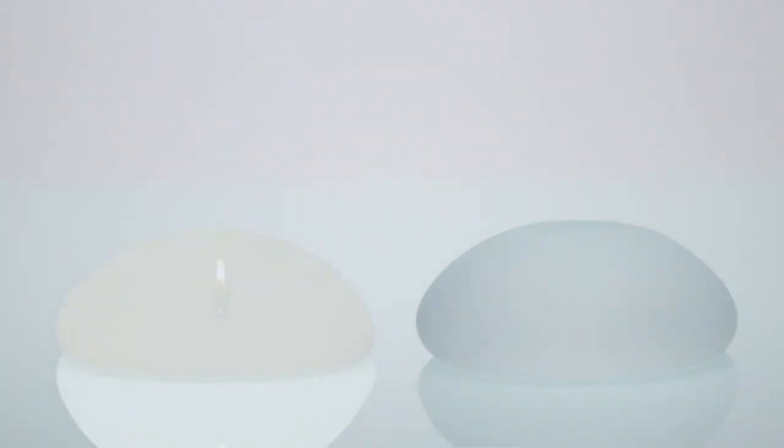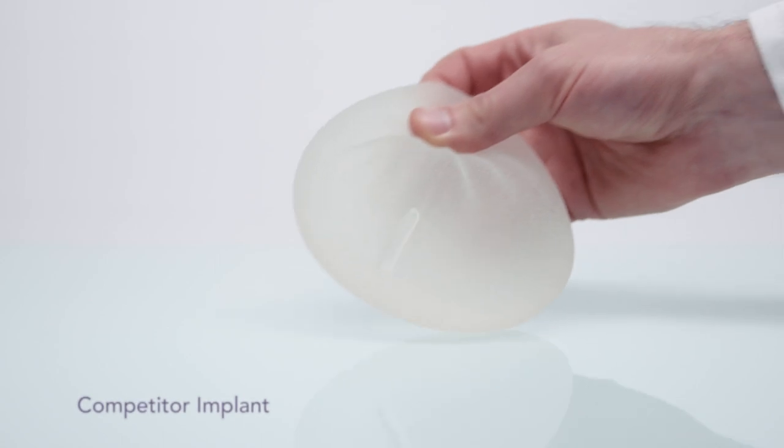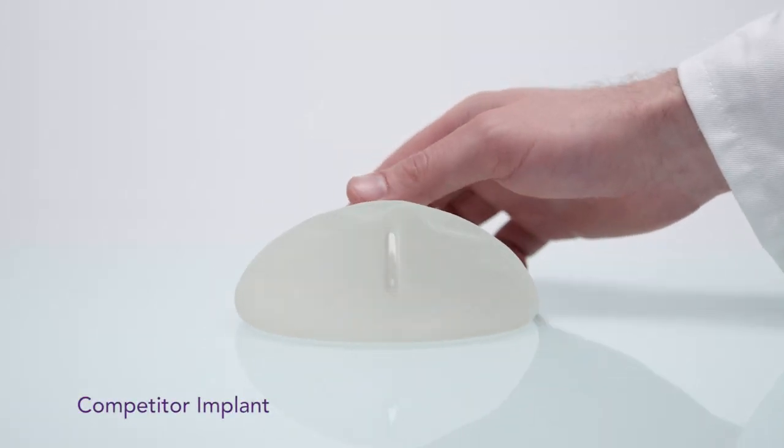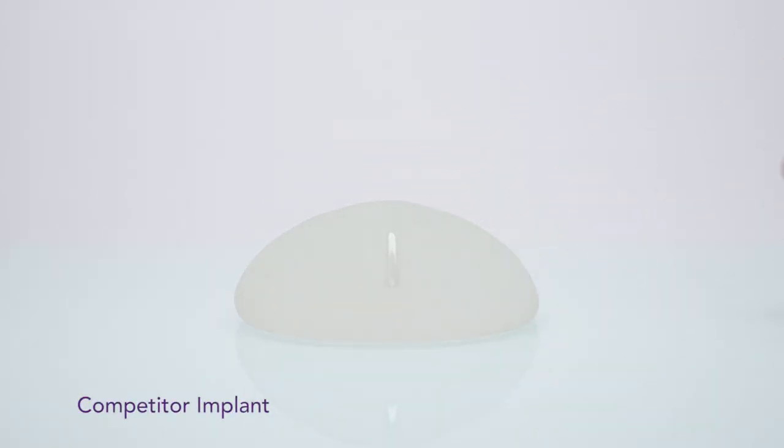An important aspect that is often overlooked when choosing implants is the surface. Some clinical data suggests that the surface texture of a breast implant can affect the risk of breast enhancement complications. Implants with a rough texture may lead to complications due to tissue irritation and inflammation.